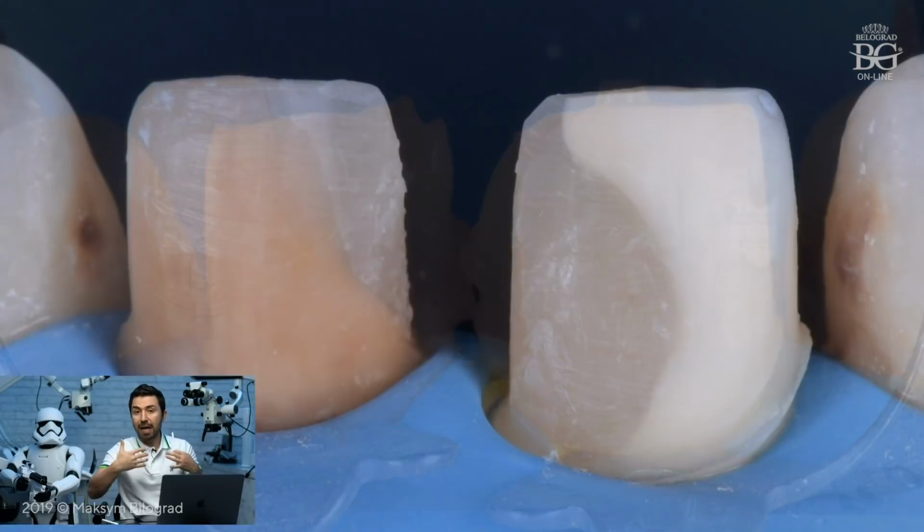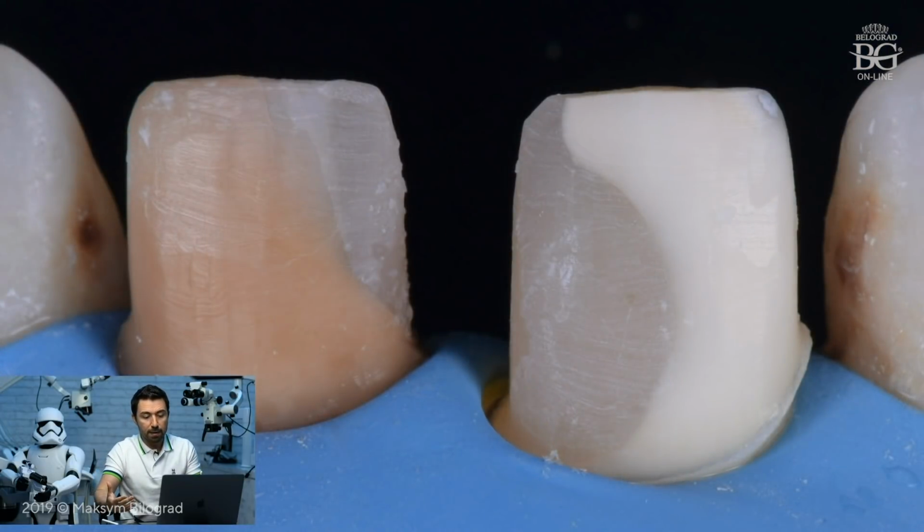And then in this case, I continued preparing teeth with the rubber dam, because since I have rubber dam, no bleeding, no soft tissues, I can do some parts of the preparation and get all the benefits and comfort for myself for controlled preparation.